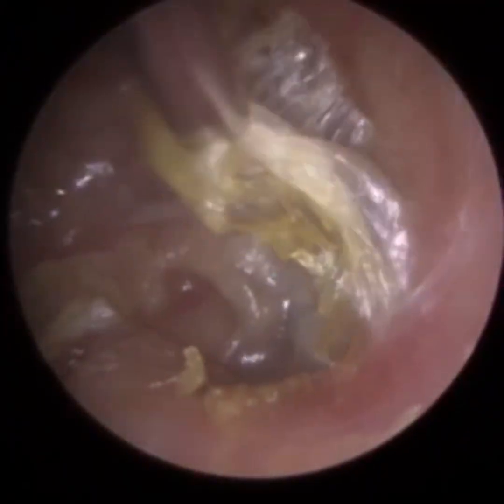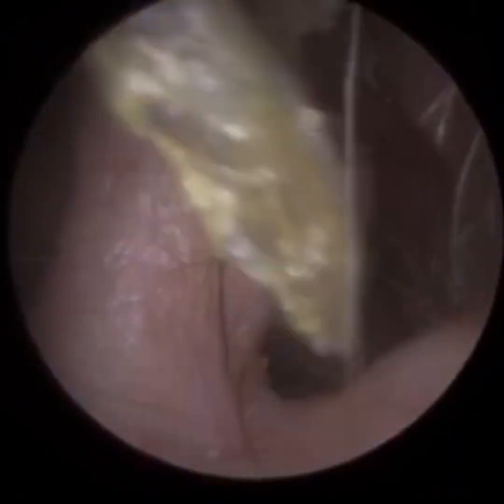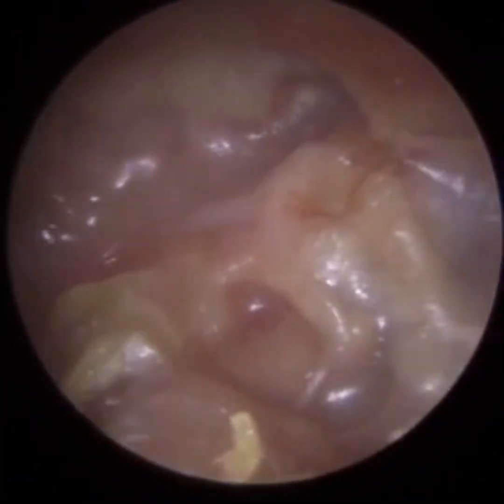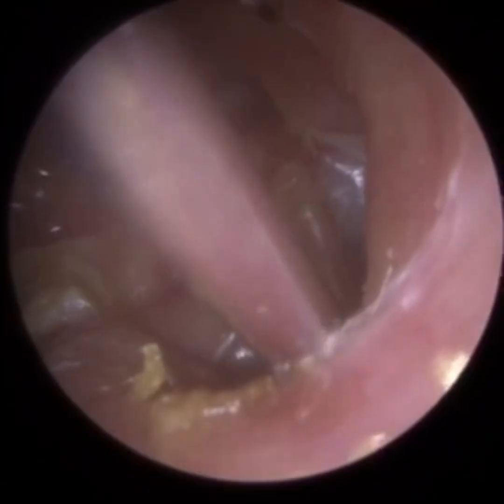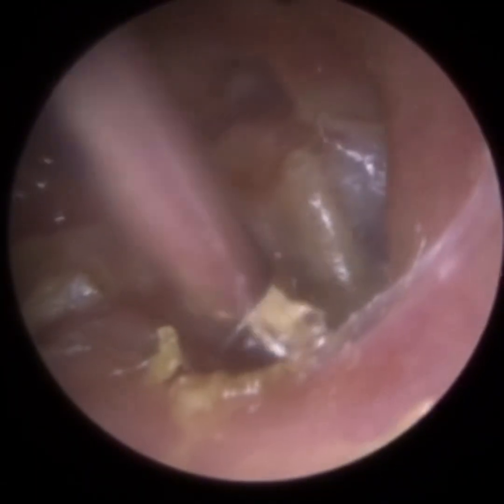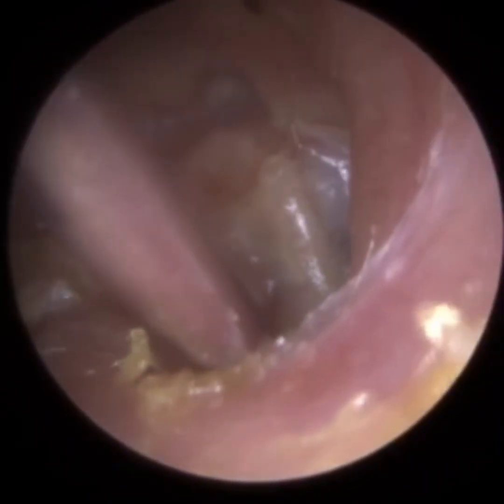So this is now the patient's ear canal. This is the normal ear. This is what you're normally seeing in a normal ear. This is where I would normally work when I'm removing wax on the right hand side. And in the middle you'll see this little ridge. That's where the back part of the ear canal would be. Where that ridge is, just to the left, you can see it goes up and down. That's the old ear canal. That's where it would normally be. So you can see how much is drilled away.